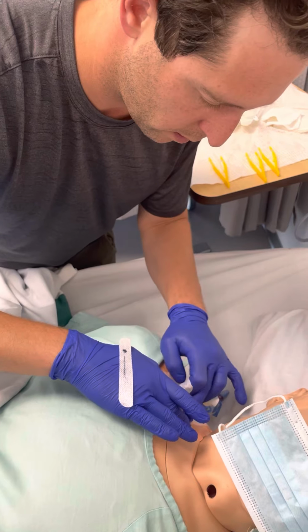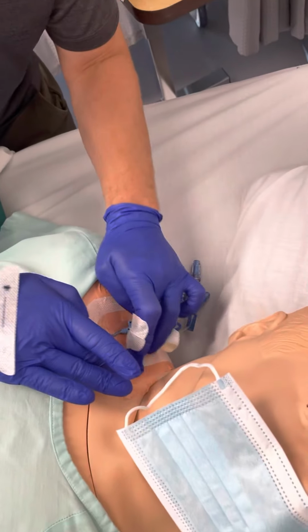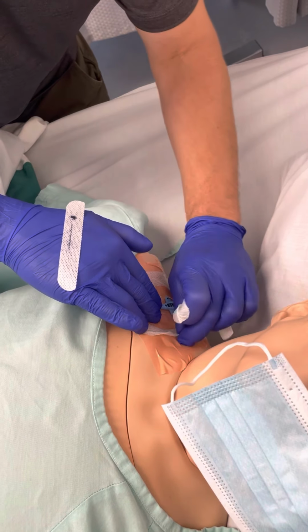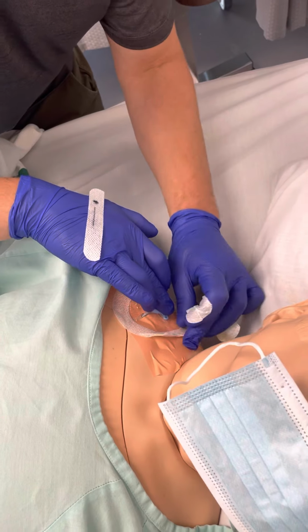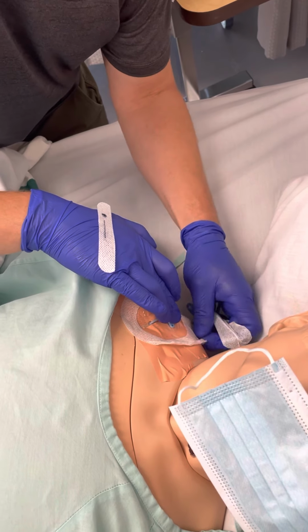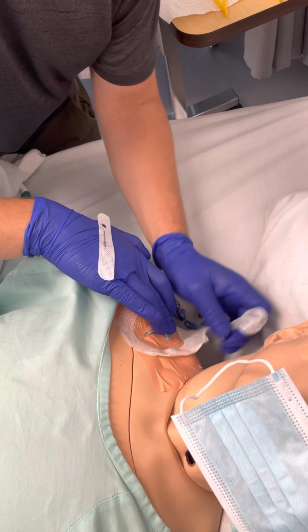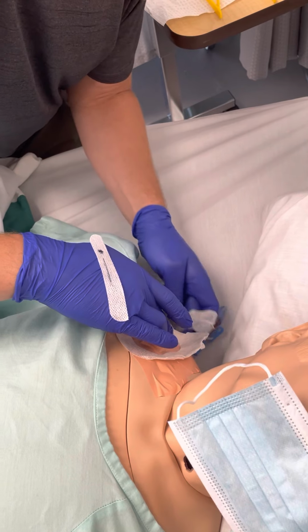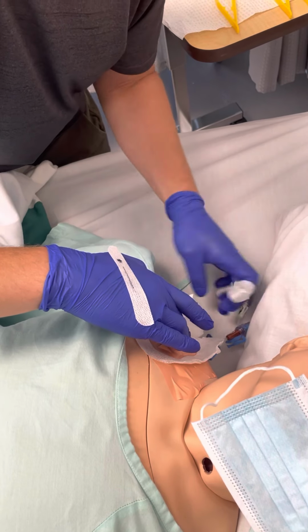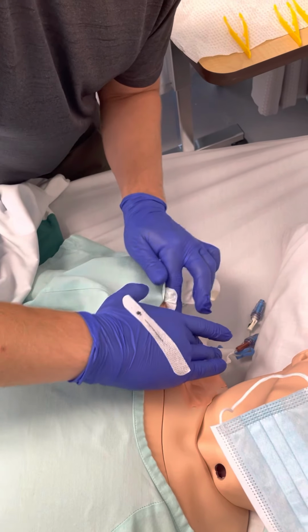And Pat, I'm just going to start peeling away. Now, this did not go as well as I wanted. Good. Peeling away. I'm just going to hold this secure on the hub here. You tell me if you need me to stop or you need a break. Okay. Good. And I pull away to have it release. Okay. Good. Peeling away at the edges here.